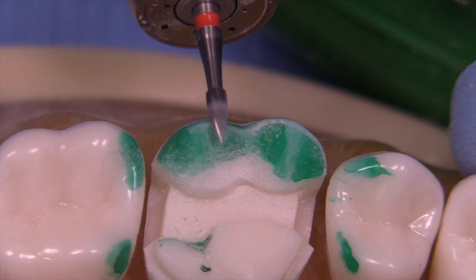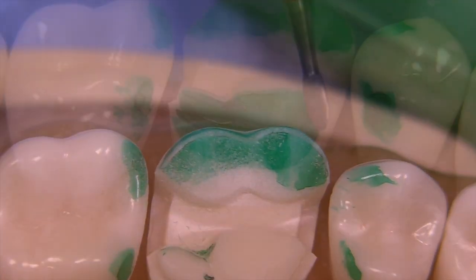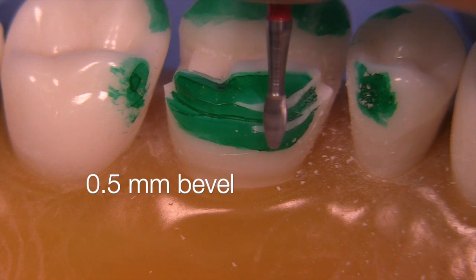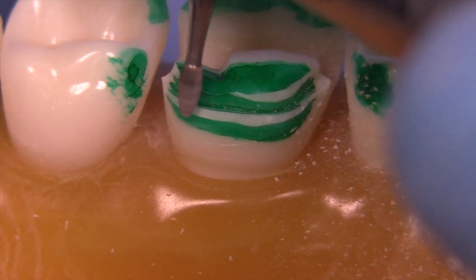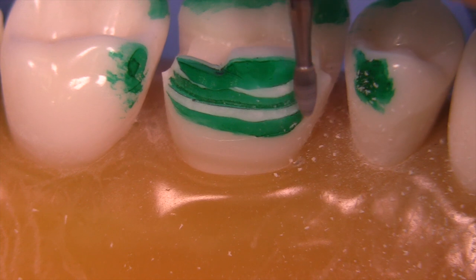We don't want this margin to end with sharp enamel rods that could be easily chipped off. A similar process occurs on the lingual side, where we need to make a bevel that's a little wider. This bevel doesn't need to be narrow because it's not an aesthetic concern — it needs to be more robust and supportive of this area, which will experience significant force from the functional cusp.